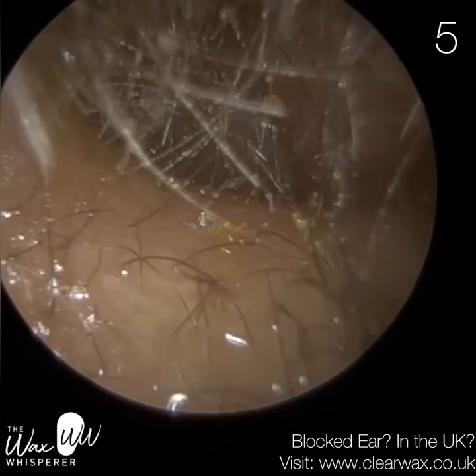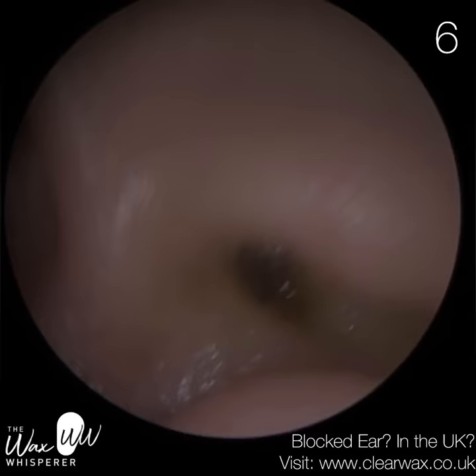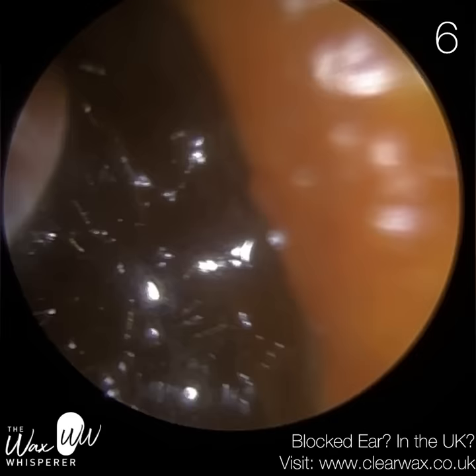With these hairs, if you pull them out from the follicles, sometimes patients can develop a furuncle because of folliculitis. These hairs are there for a reason — they help to filtrate the air. Of course, some people have more hairs than others; it's just individual differences. Patient five was successfully treated.